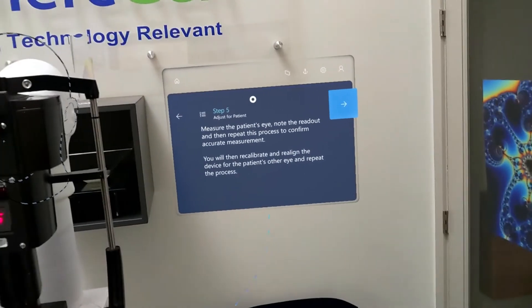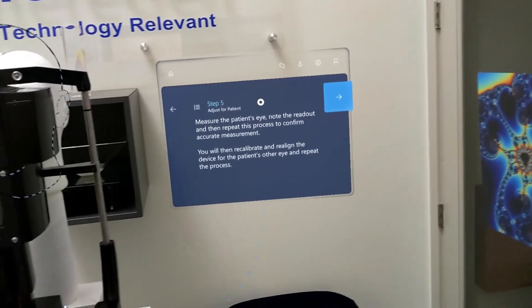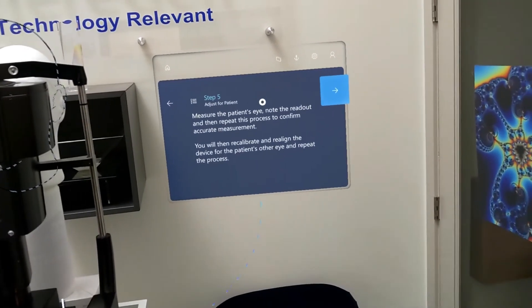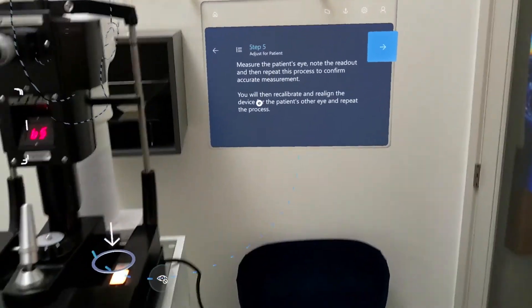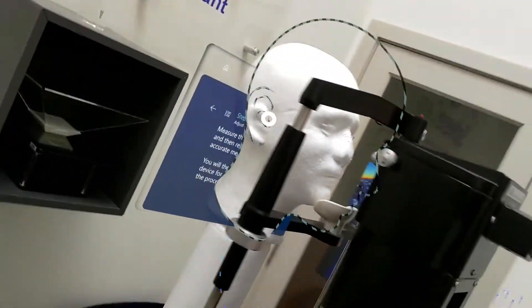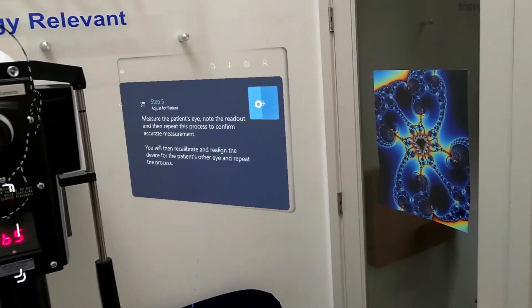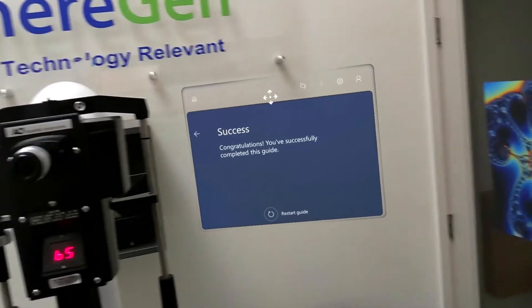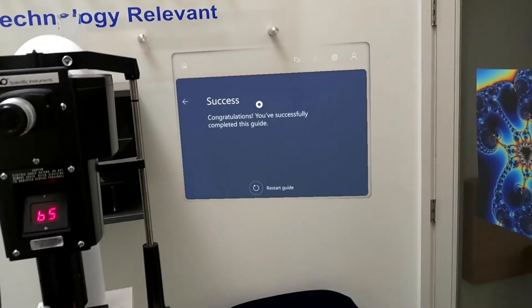Measure the patient's eye. Note the readout and then repeat this process to confirm the accurate measurement. You will then recalibrate and realign the device for the patient's other eye and repeat the process.